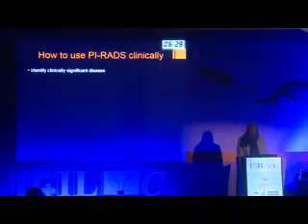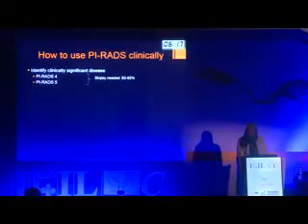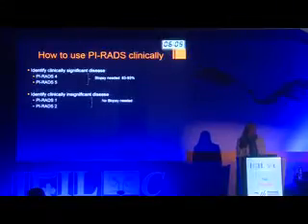So how can we use PIRADS clinically? If we mention in our report that we have a PIRADS 4 or 5 lesion, then this is clinically significant disease, and a biopsy is further required for this patient to confirm the diagnosis and establish the first next step for his management. Then if we mention PIRADS 1 or 2, then this patient has clinically insignificant disease, and we can avoid unnecessary biopsy in these patients.